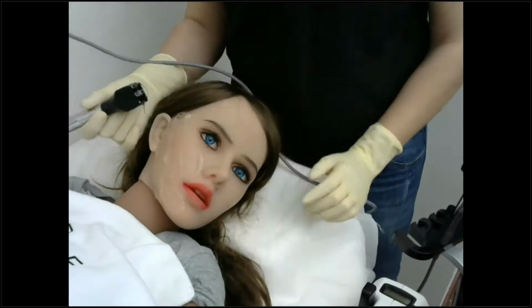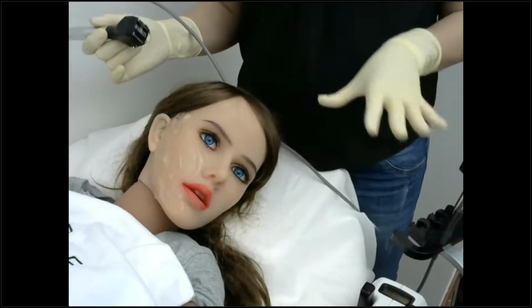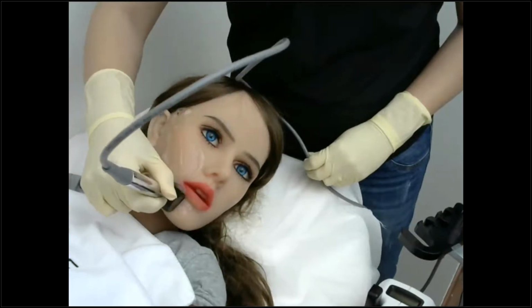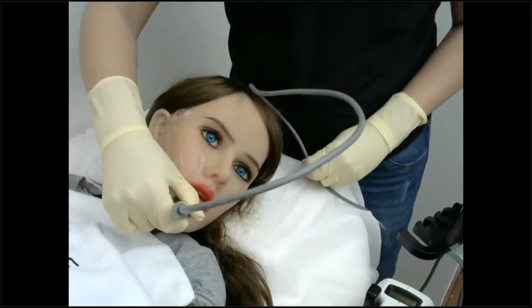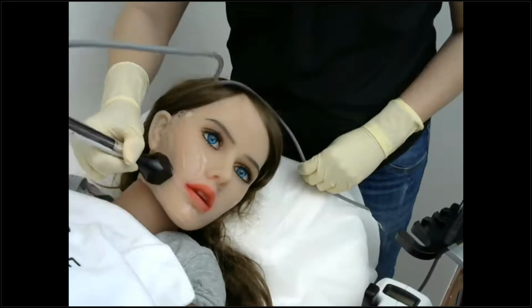I'm going to treat the lower half of the face at the moment. Before I actually start the treatment, I want to make sure that I have good contact with the treatment zone. And you can see that I'm pressing a little bit and I'm holding my applicator perpendicular to skin.